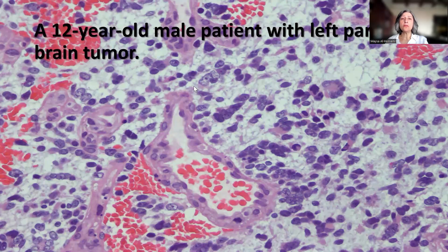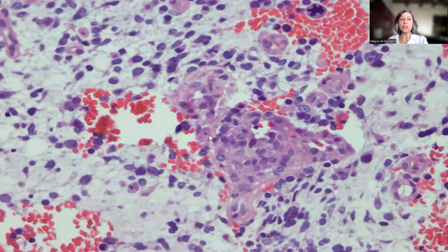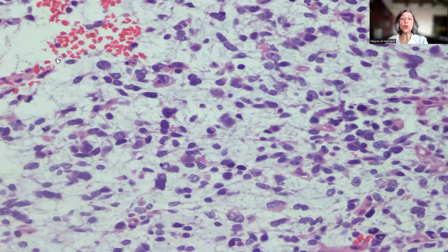This is a case of a 12-year-old boy who presented with a left parietal brain tumor mass that was resected and showed a highly cellular tumor growing in a myxoid background, showing very characteristic tumor giant cells with acidophilic cytoplasm. There is apoptosis, as well as microvascular proliferation. There is another focus of the tumor with abnormal mitotic figures present, as well as marked microvascular proliferation.